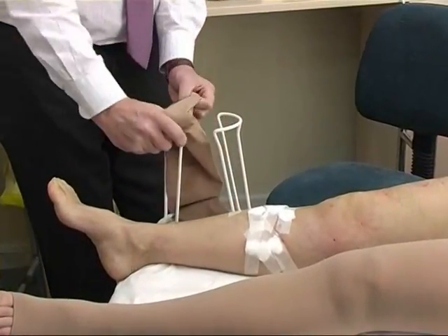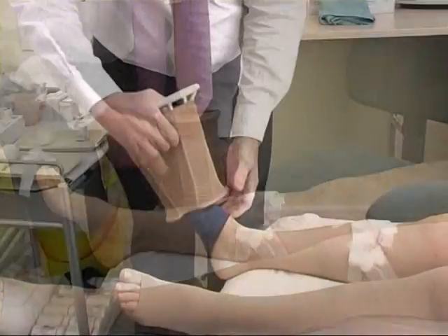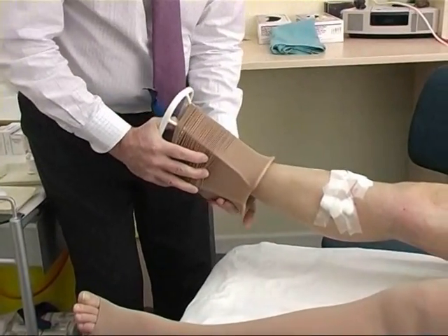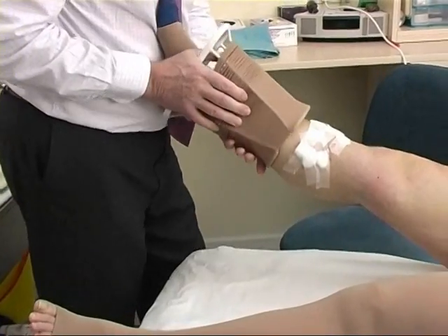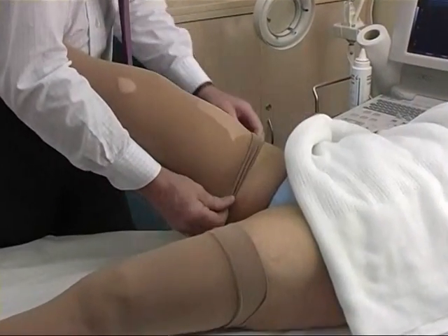These sclerotherapists recommend use of a Class II medical compression stocking. This is applied here with the aid of a frame which greatly facilitates application of the stocking. The stocking is worn for seven days following treatment.